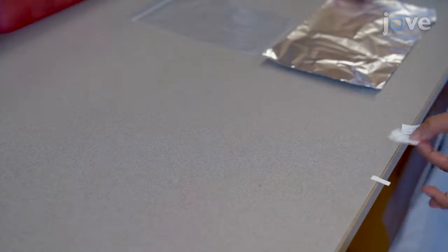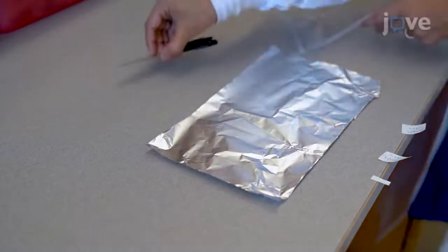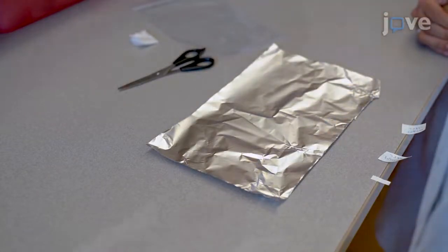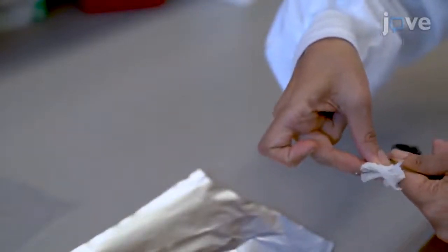To acquire hair samples, after obtaining written informed consent, get materials ready, including a thin label, 2 participant labels, a pair of scissors, an unfolded piece of aluminum foil, an alcohol wipe, and a plastic bag. Wipe the blades of the scissors clean with an alcohol wipe.